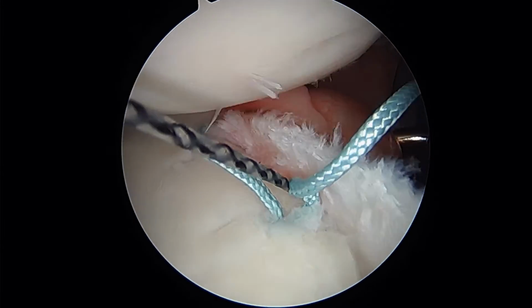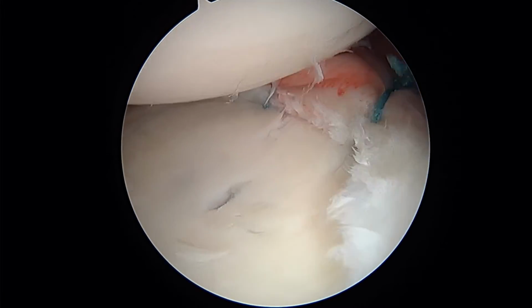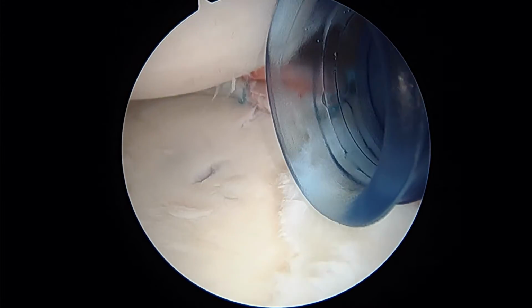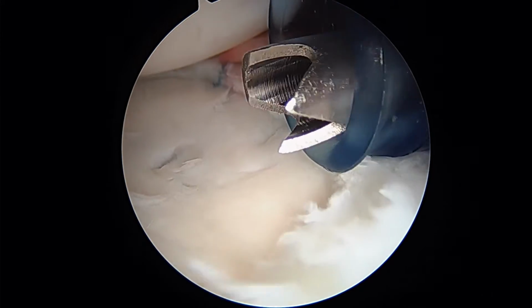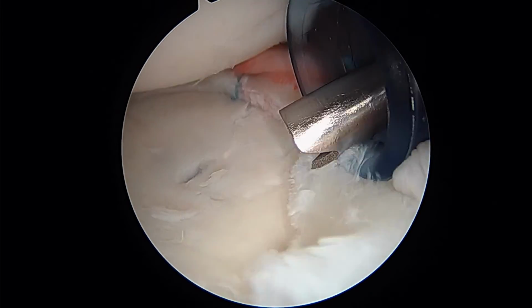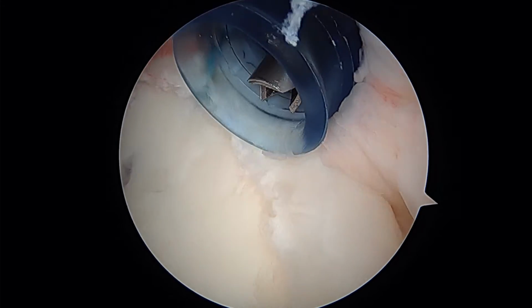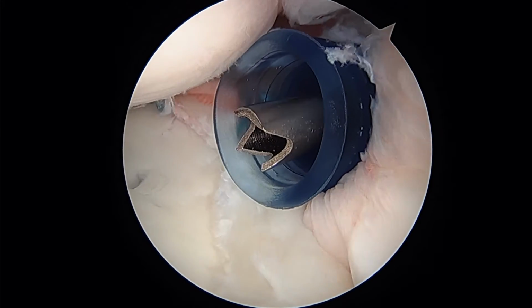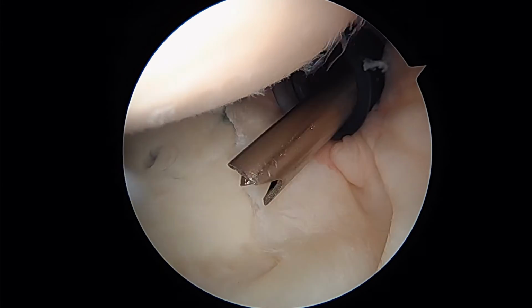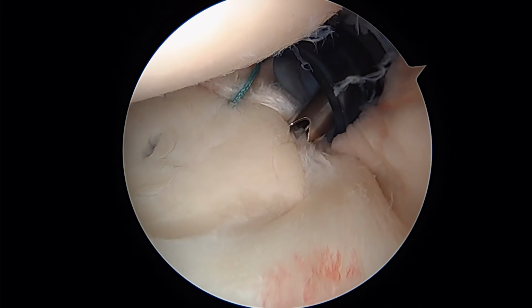Okay, so I like the way those two look. That's really holding down that labrum. We may have to place another one because as you can see, there's still some laxity that I can appreciate here. Even though you don't have a biceps pulling on it, there's still some labral laxity here. And I don't know that I'm fully comfortable just leaving it. I'm trying to rotate the scope so I can see it better. That looks pretty good. Just hold like that. If we're going to put one in, I'd want to put it in right about here.